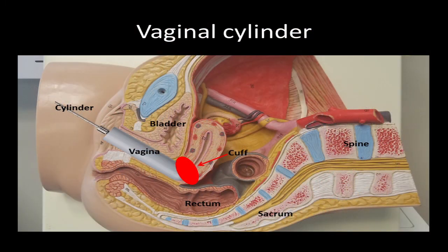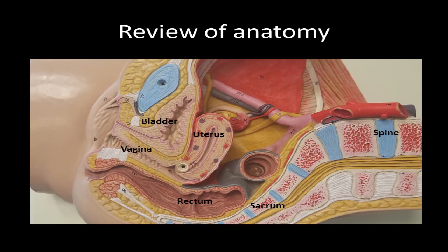For example, after surgery for endometrial cancer, the vaginal cuff, where the vagina was sewn back together, is treated with a cylinder to treat the top of the vagina, the area at highest risk after surgery. To decrease radiation dose to tissues surrounding the tumor, such as your bladder, rectum, or bowel, and to optimize your radiation dose delivery, we may need to augment the radiation using additional hollow tubes that go into and around the tumor. Depending on the size, location, and local tumor extension, different types of cervical applicators may be used.